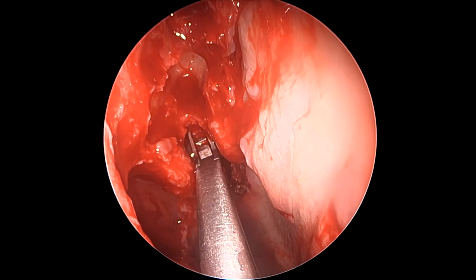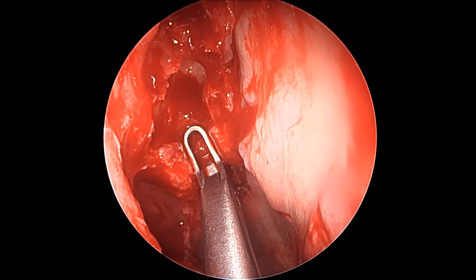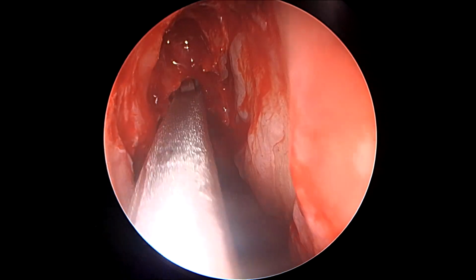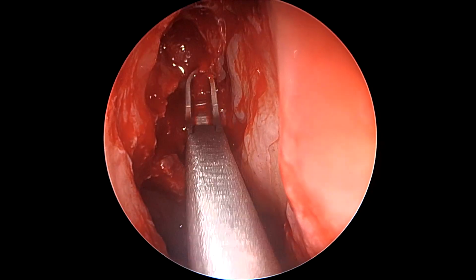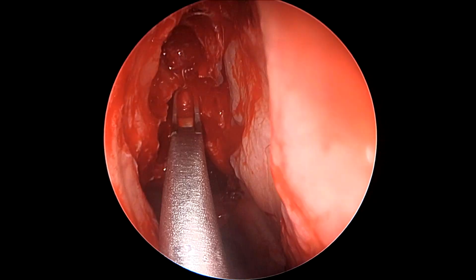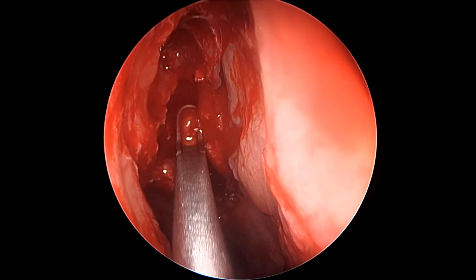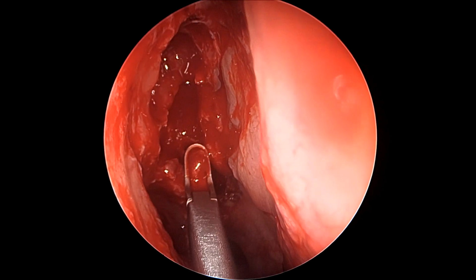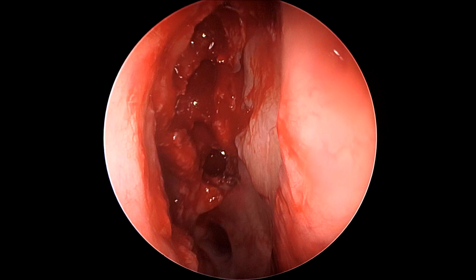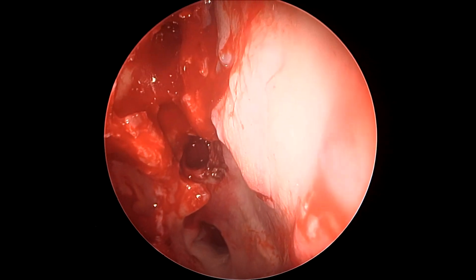Once again, this is very important in clearing the entire ethmoid cavity, and most importantly, in thorough irrigation of the ethmoidal cavity with saline and steroids to prevent future recurrence, and for easy in-office endoscopic examination of the ethmoidal cavity. Imagine, leaving septations here would obviously lead to hidden recesses and possibilities of disease recurrence. Also, not removing enough ethmoidal septations often leads to neo-osteogenesis because of scarring and leads to complications should these patients require repeated surgeries.